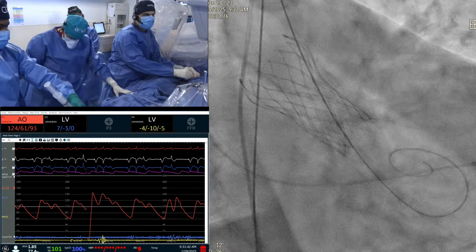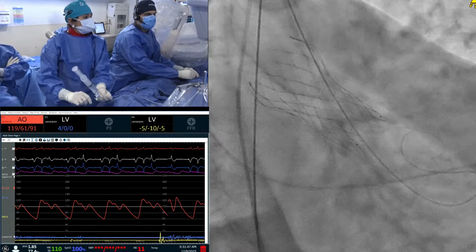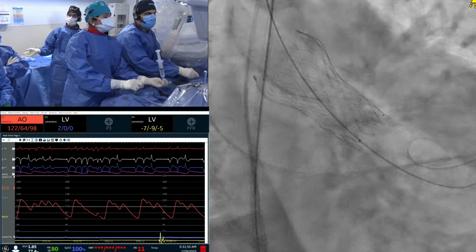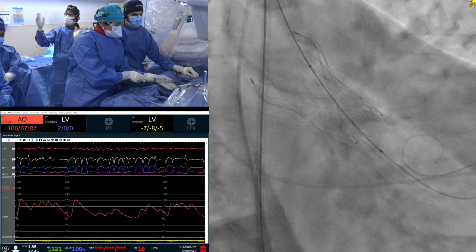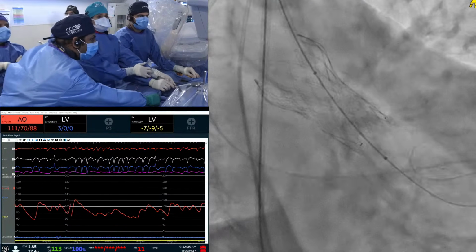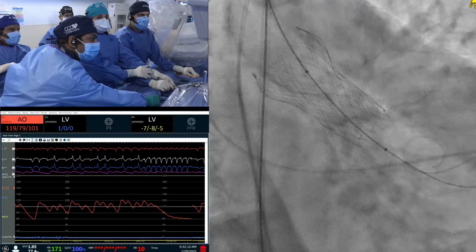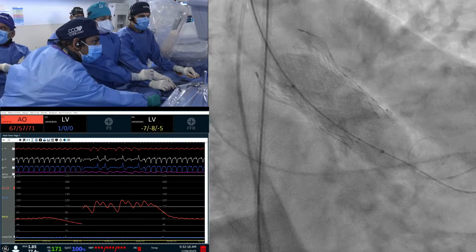Nothing really. I think what you saw earlier, it rolled up, right? Because it's a small LVOT, it can push the valve up. So you have to watch for that. And we usually do what we call a semi-rapid deployment technique. Traditionally, the Evolut platform will say, go slow, start to flower slowly, you control pacing, and then you make annular contact at 80%. But what we do now, as you can see earlier on, is that we actually let them post-dilate first. What balloon are we using? 21. 21 True? Okay, a 21 True balloon is post-dilating.